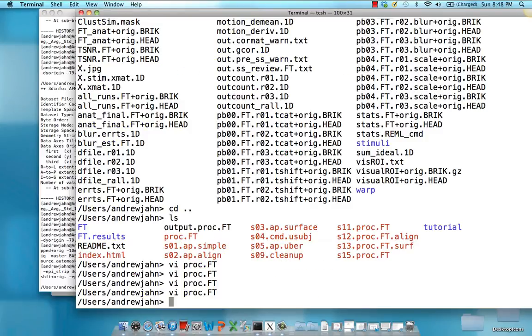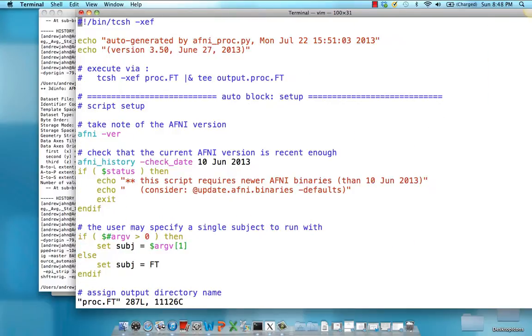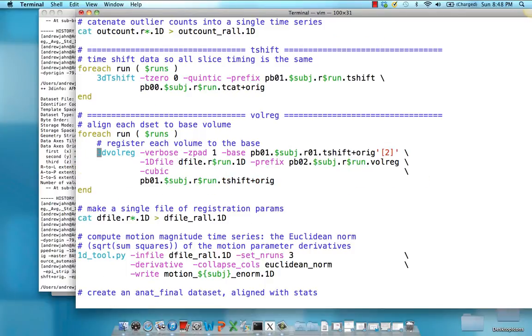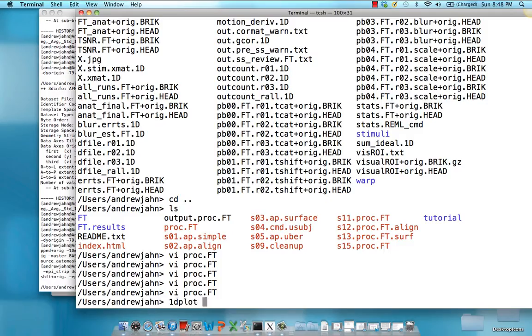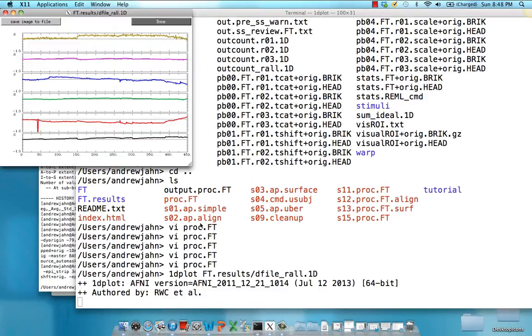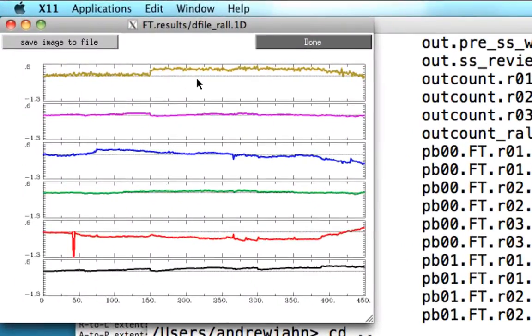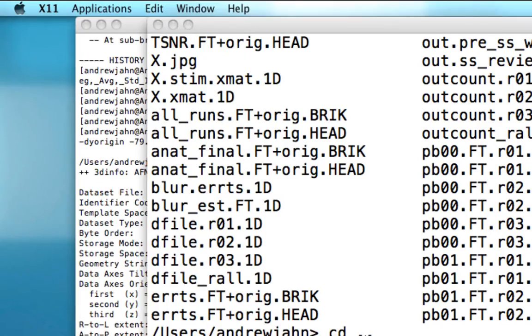Let's take a look at that. Using 1D plot on the dfile_rall output, you can see the first three columns are X, Y, and Z, and then roll, pitch, and yaw. You can see we seem to have a spike here, and we'll take care of that later.